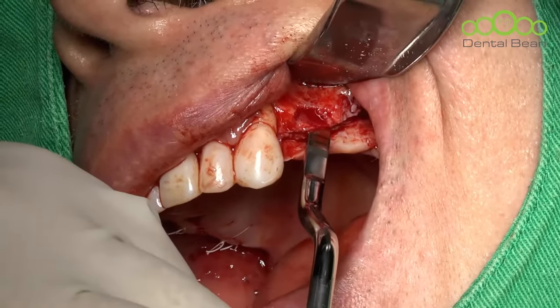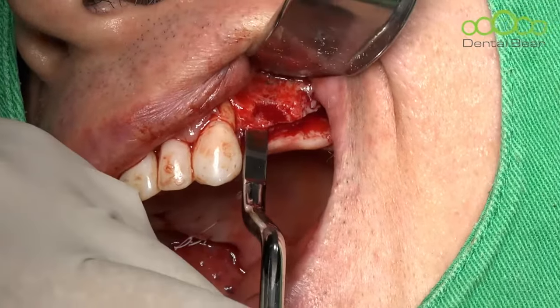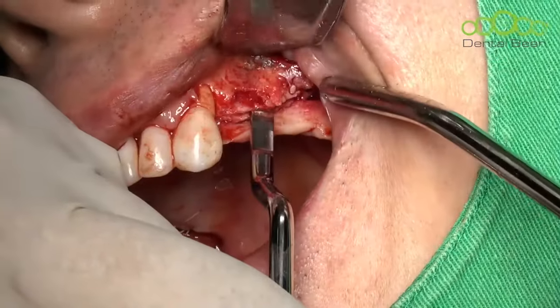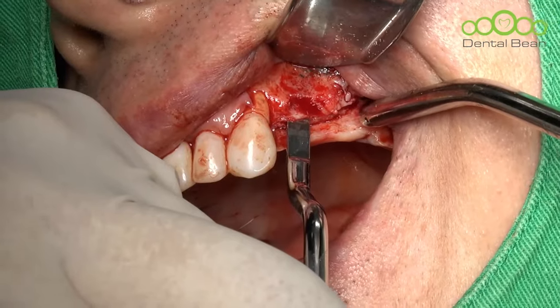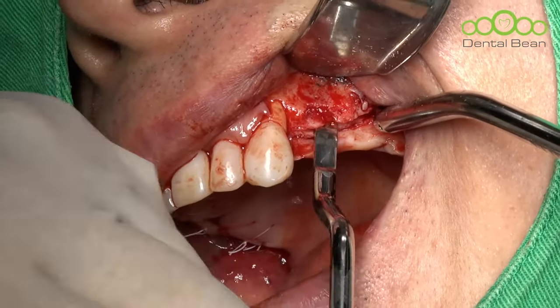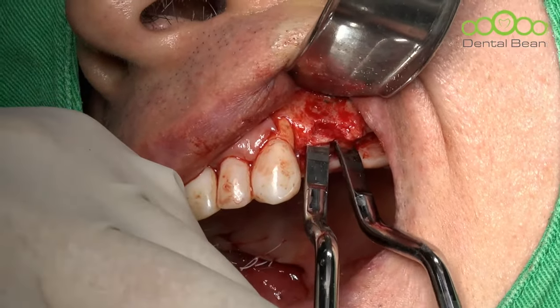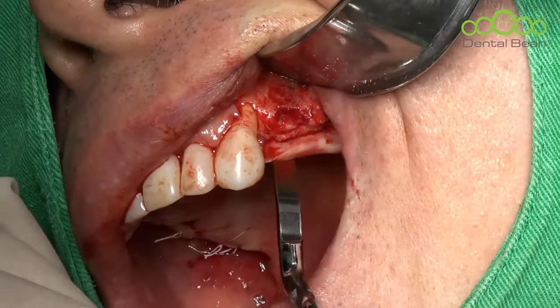It's a little uncomfortable. Please try gentle malleting to minimize discomfort. This patient has very dense bone at the premolar, so it is slightly inconvenient. The patient may feel discomfort. Sometimes I give vertical osteotomy even when I use a saw. And this is 2.0. Cannot do full depth insertion. Just focus on the enlargement of the coronal ridge area.